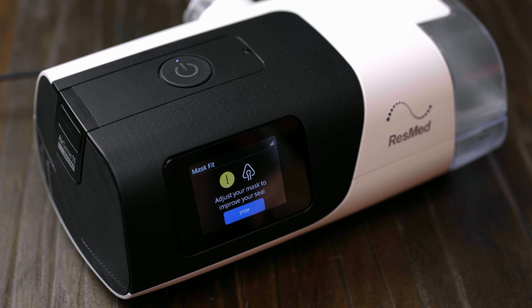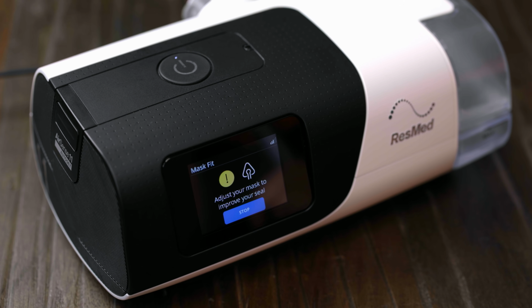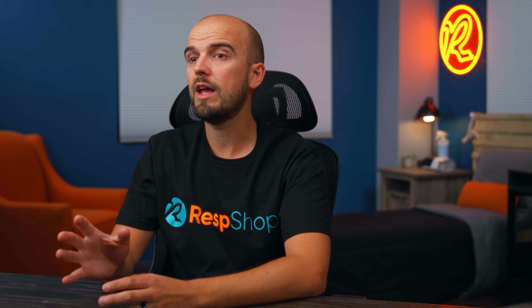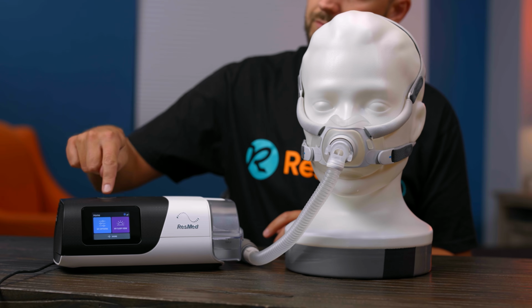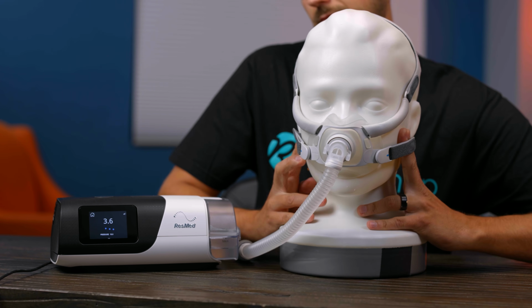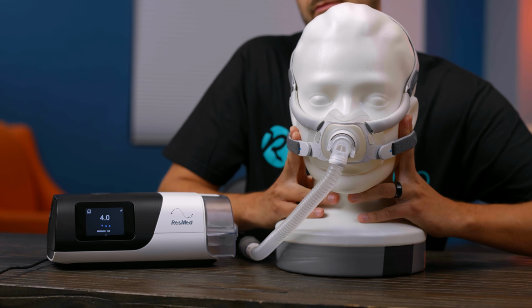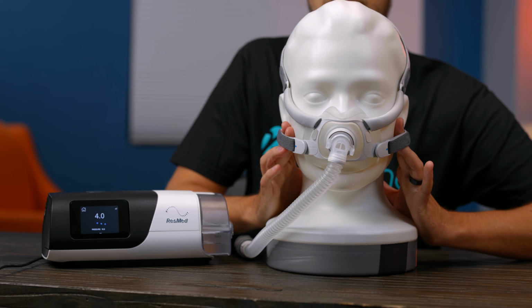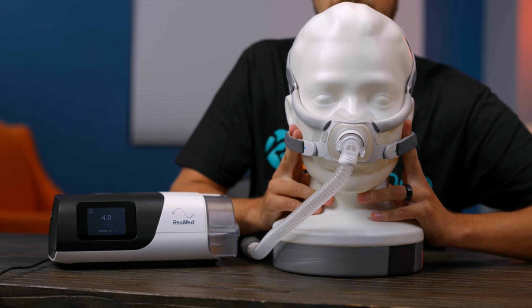If it isn't, try experimenting with the headgear tightness and cushion seal until you pass the test. And if your machine doesn't have this test or you can't find it, a good manual way of getting the right tightness is to take your middle finger and index finger on both hands. You should be able to tuck these under the straps on either side at the same time. If you can't, then the seal is too tight. And if you can fit more than 2 fingers on each hand, then it's too loose.